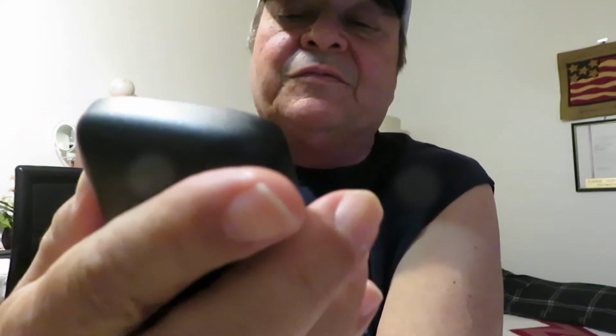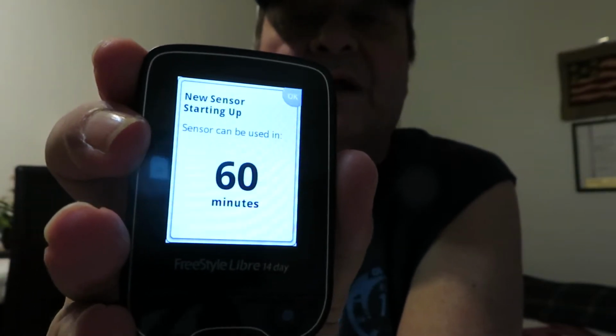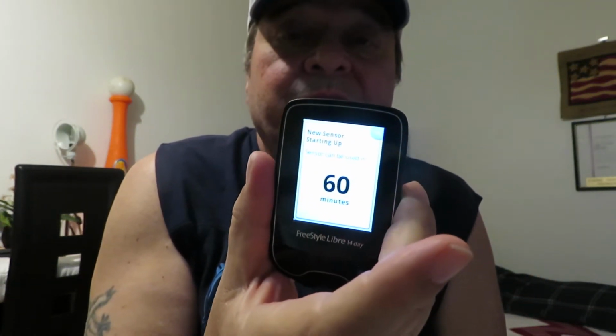Now it went, and we learned from last time, it has to have 60 minutes to warm up or program or whatever. I went to my diabetes doctor today. That's why I'm here. It's later in the evening. It's 9:45 at night, and I learned a lot with that doctor and re-evaluated, and they put this in their system. Supposedly they're emailing me, and then I was invited to get into Libre link, and then it'll gather up all your information and they can read it from the office. So I'll have another appointment.